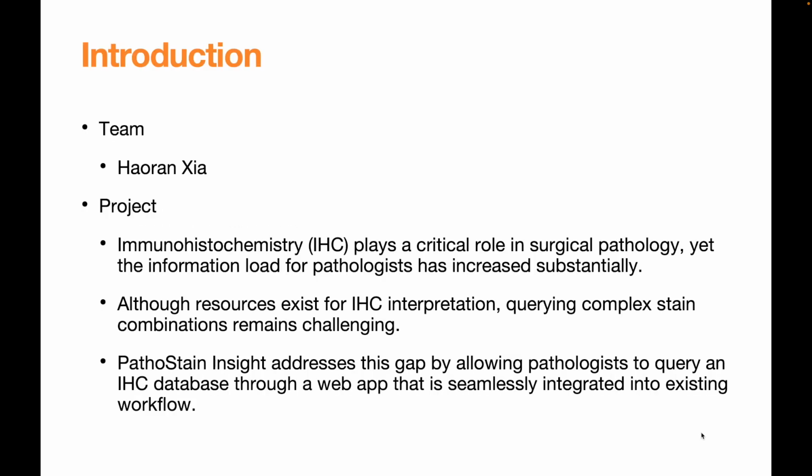Let's start with the introduction. This is a solo project, so I am the only team member. I was responsible for front-end, back-end, database, and deployment. For this project, we'll be focusing on immunohistochemistry, or IHC.